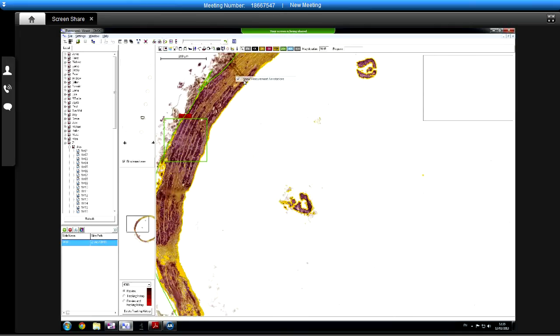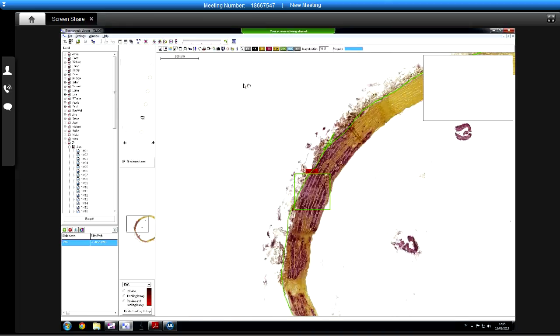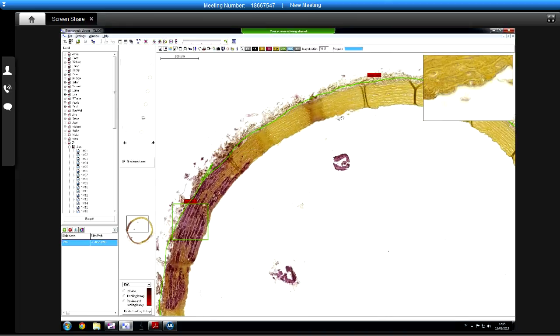Yeah, let's try doing the inverse of what we want to do. So this is all completely negative, isn't it? Okay.